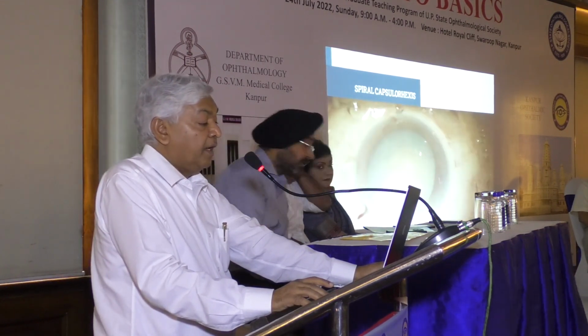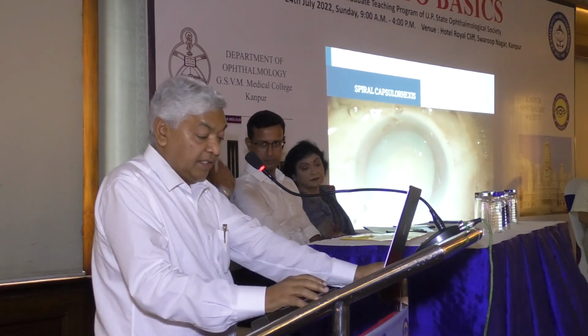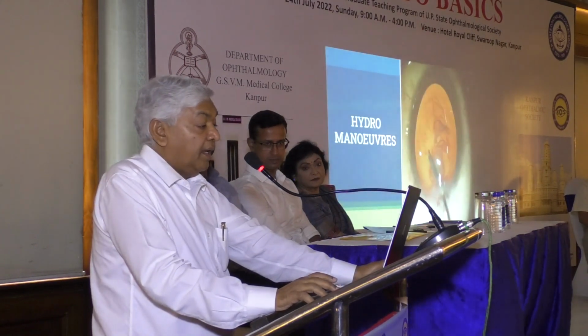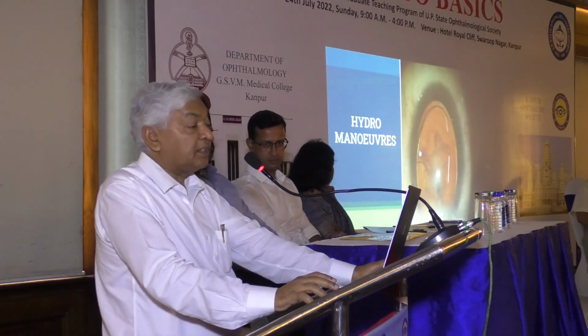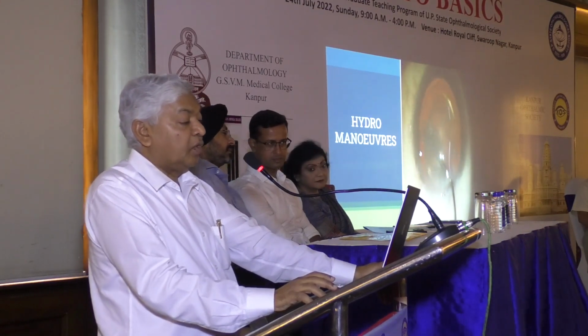You can see how many rounds we have made, and you can see the rhexis. So you have to learn the rhexis. Hydrodissection is an integral part of phacoemulsification.